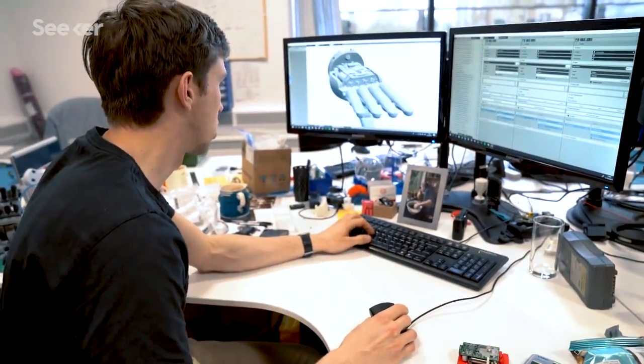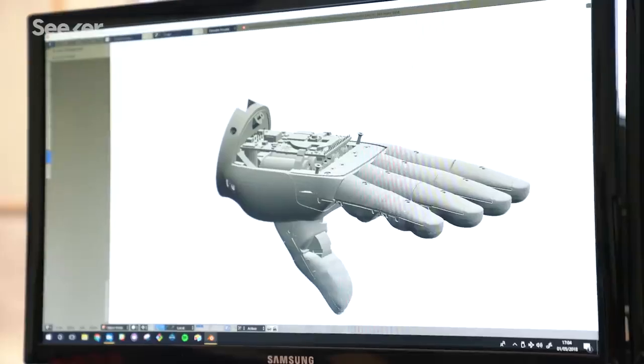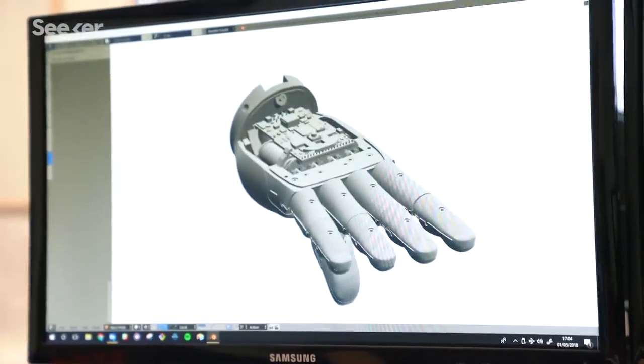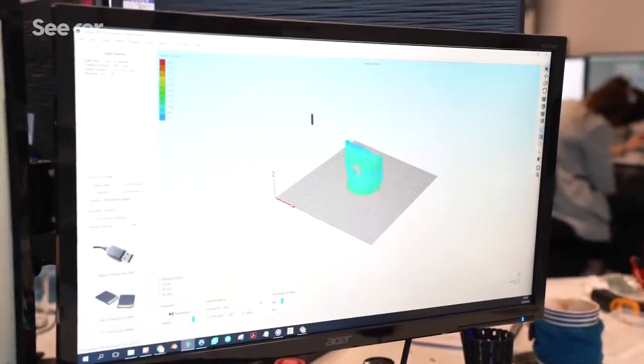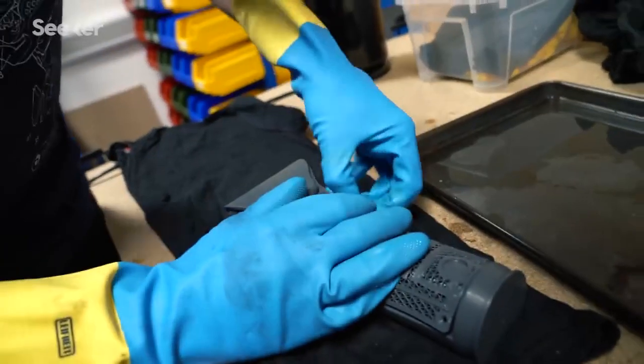The first thing that happens is that a prosthetist will get a model of the user's arm, which could be physical or digital from a 3D scan. We feed that into our software algorithms to create the bespoke Hero Arm for that individual, then export the files for the 3D printers, 3D print them, and assemble everything together into that person's Hero Arm.